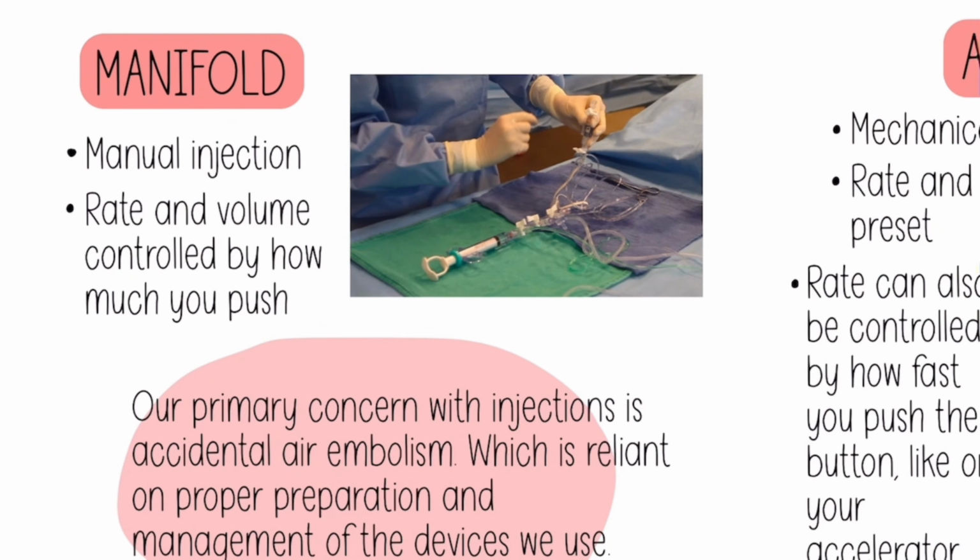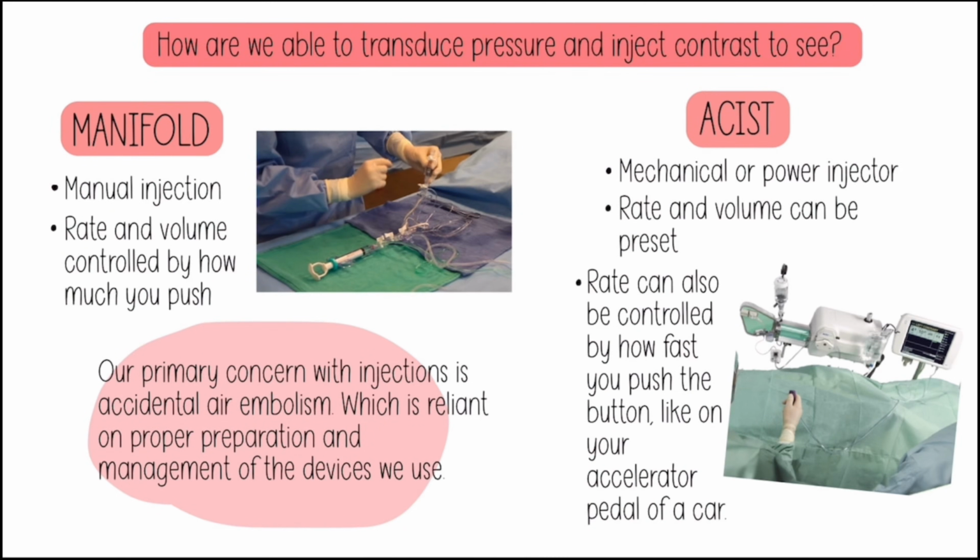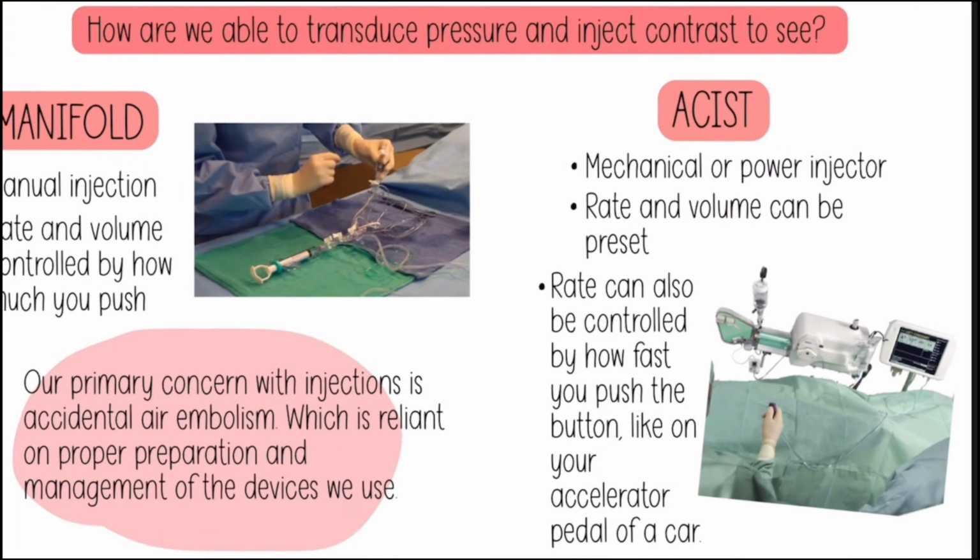Now, our primary concern with injections is air embolism, accidentally injecting air, because this is outside of the body. So if I have a crack or a loose connection, air can enter, and then when I inject, it'll go in the body, and that can be very dangerous. We don't want that. So you really have to know what you're doing, learn the manifold like the back of your hand, know how to do proper injections. If you see air, know how to troubleshoot it without accidentally injecting it into the body. So those are very, very important skills to learn and practice.